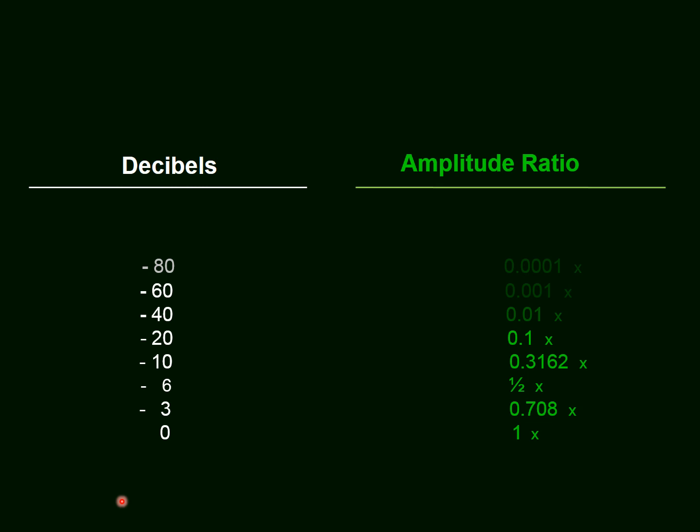Similarly, the decrease in amplification is shown as minus decibels, easy to understand.